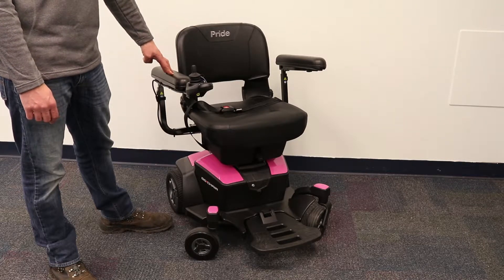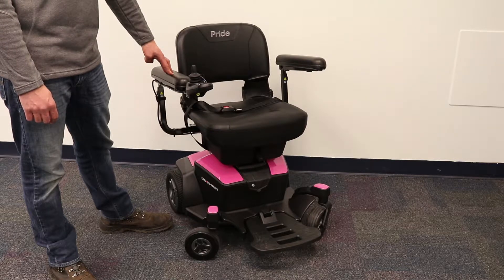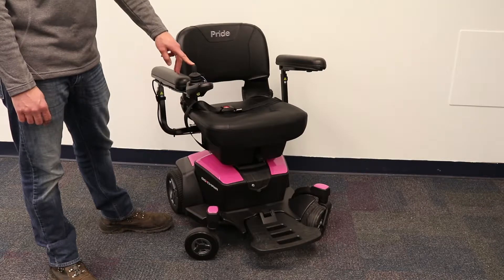Now that we went over the details, just how exactly do you use the power chair? Well, when you have the chair turned on, you will use the joystick to drive in whatever direction you push it in — the chair will go.